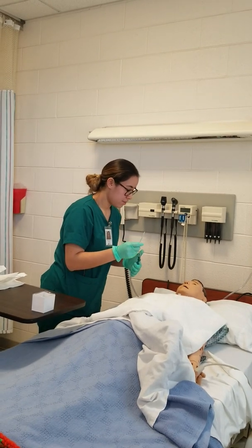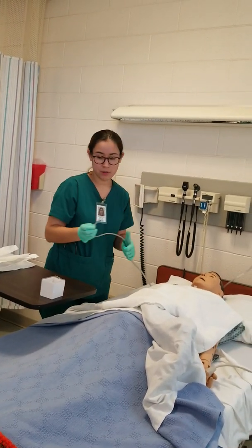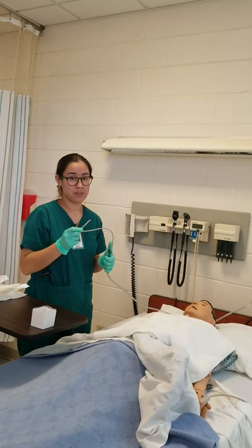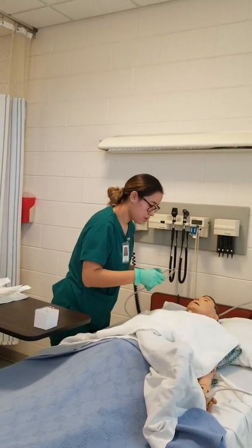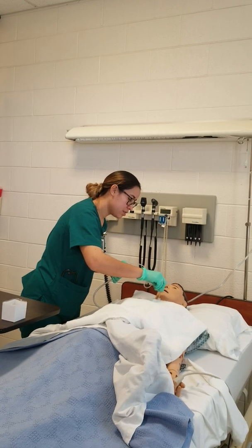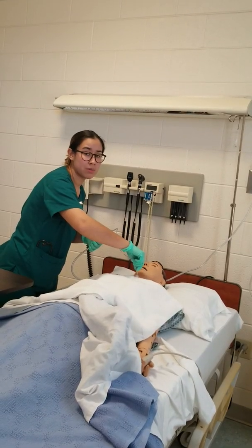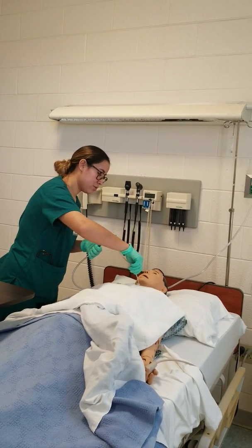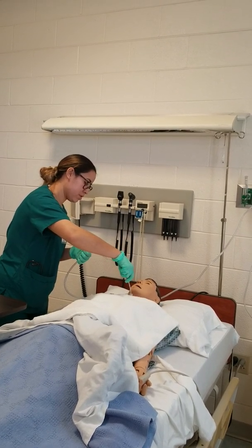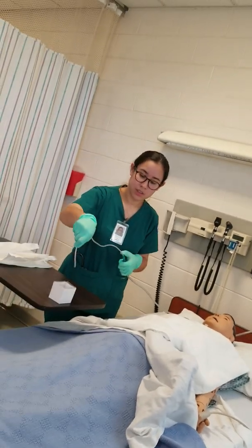I'll let him know. Are you ready? First, before I go in, I would go ahead and dip the catheter in the solution before I start suctioning. I'll put it in, let him know, make sure he's ready, and then I'll start inserting. I'll go ahead and look at the mucus, assess it, and then dip it in the solution again.